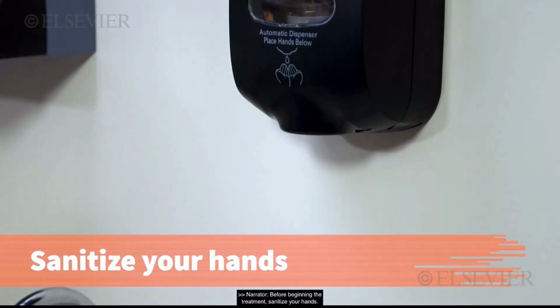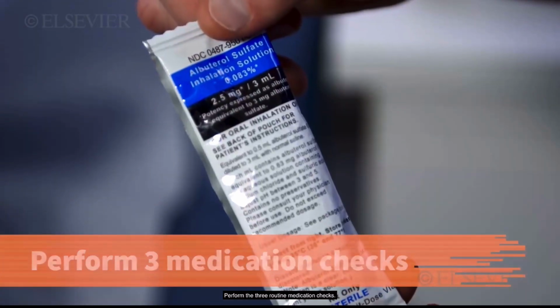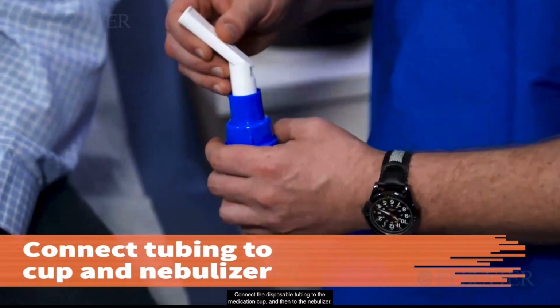Before beginning the treatment, sanitize your hands. Perform the 3 routine medication checks. Insert the drug into the nebulizer medication cup. Connect the disposable tubing to the medication cup and then to the nebulizer.